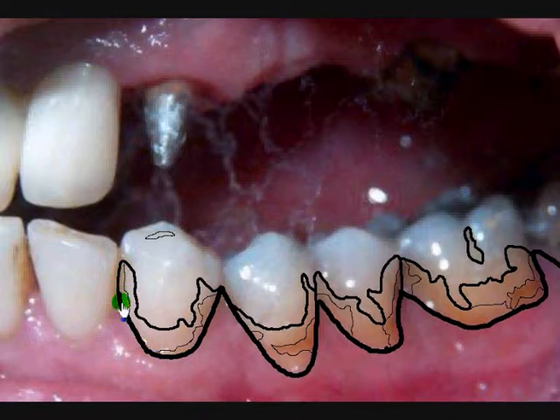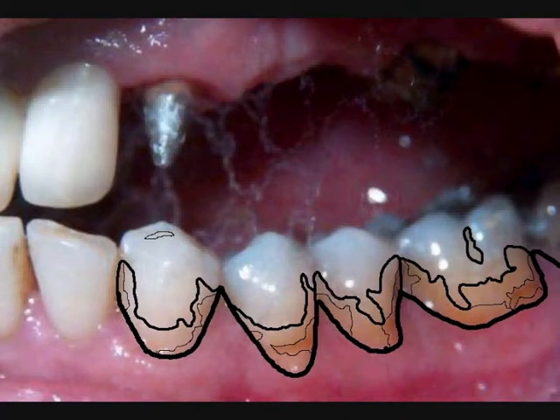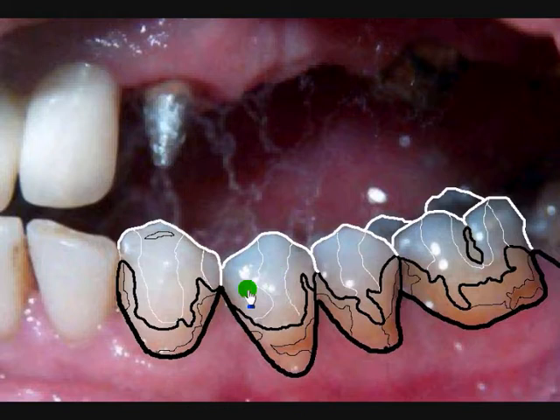So you see that here we have the body divided from the enamels, and the body itself divided into where we have more chroma and more richness of color. The same is done for the enamels. I will contour from the tip of the occlusal cusps all the way and divide the enamels where they seem to be with less value compared to a higher value for their areas.